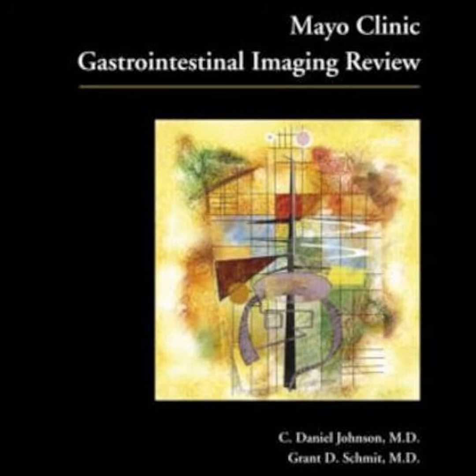The text covers the MRI proctogram, which moves beyond static snapshots to evaluate defecation disorders dynamically. Because anatomy can look completely normal at rest. The MRI proctogram images the patient in real time while they are actively straining. Oh, so you can physically observe things falling out of place. Exactly. It allows us to observe abnormal pelvic floor descent or anterior mucosal prolapse that a static CT scan would entirely miss.